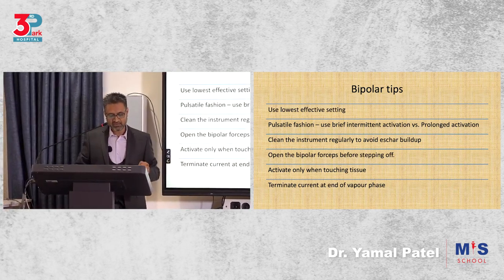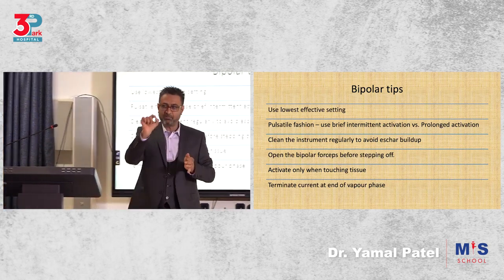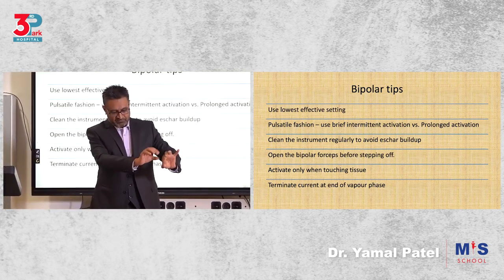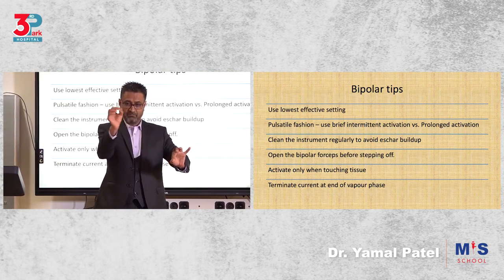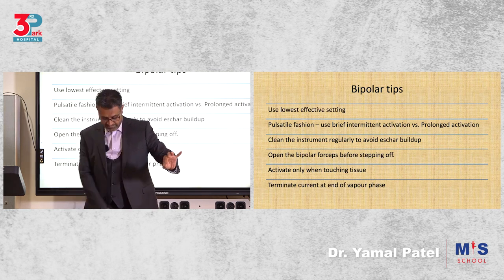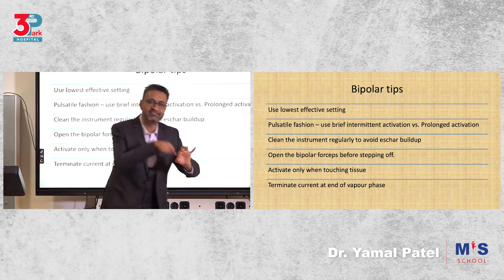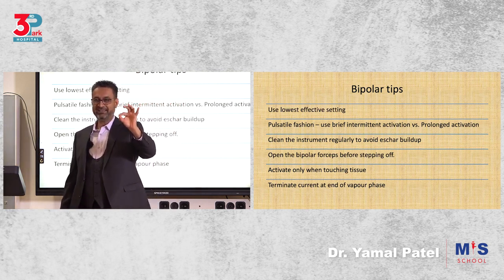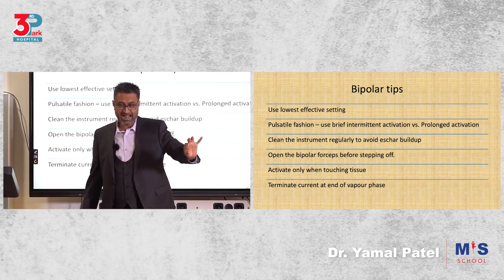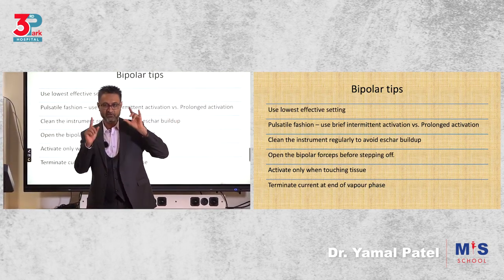Clean the instruments regularly. You open the bipolar before stepping off. Again, another important small point. These small points make a difference. When you've held it, you'll see bubbles forming around because the water or the blood, the fluid, is bubbling. And when you stop, the instrument cools down. When it cools down, it will stick to that tissue. Are you getting what I'm saying? So the way to do it: hold, activate, release, release. Did you get my point?